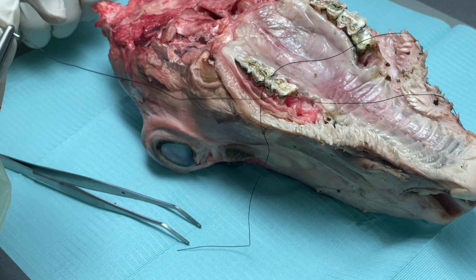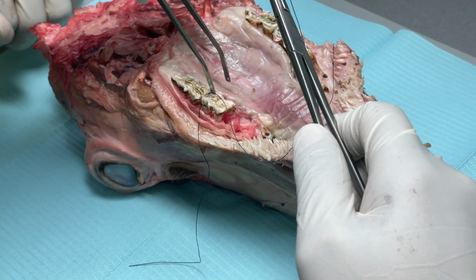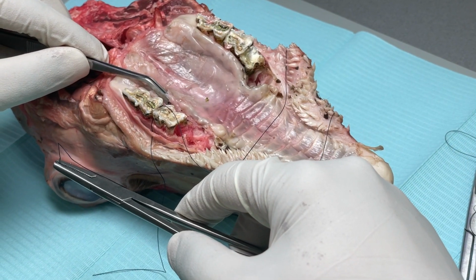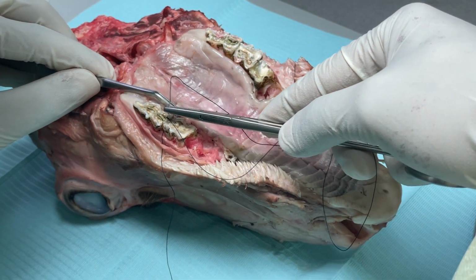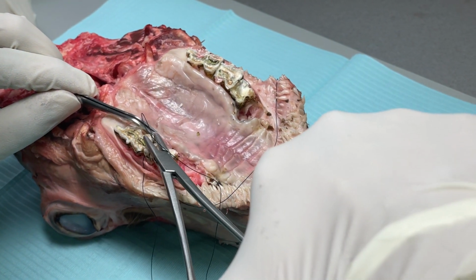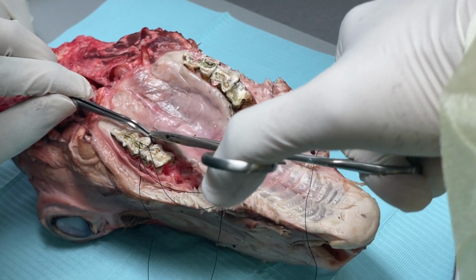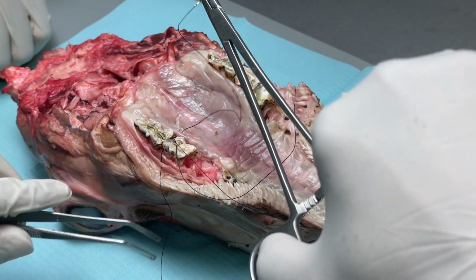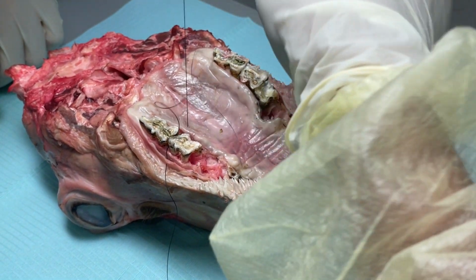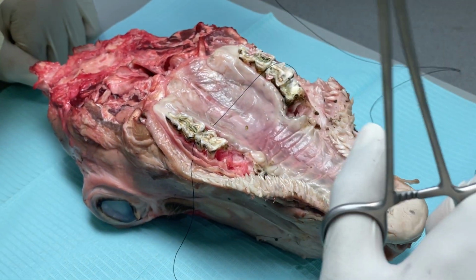Now we are doing this simple interrupted suture. On the lingual or palatal, from the inner side, I will pass it from the inner side, release slightly. I can push it in a little more, pull it following the curvature, and pull it out. Again pull, make sure that it doesn't lock anywhere. Okay, done. Now we tie a knot.